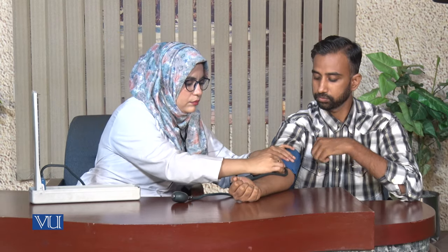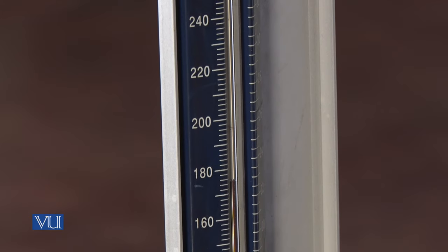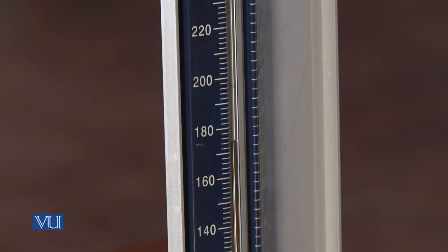Now, lightly press the stethoscope's bell over the brachial artery just below the cuff's edge. Now, rapidly inflate the cuff to 180 mm of mercury, then release air from the cuff at a moderate rate. Listen with the stethoscope and simultaneously observe the sphygmomanometer.